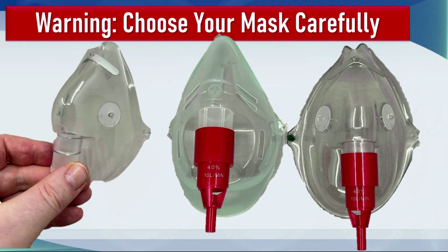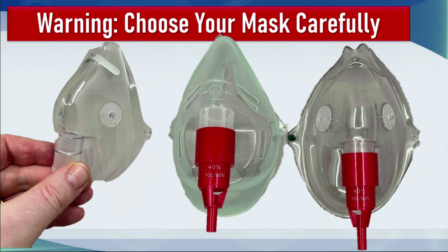The second face mask is for a nebulizer, and the picture on the left shows this more correctly, that there aren't any holes there. There's this little bit of plastic that covers over the holes on the inside, and these are used for much higher flows. And if you put this mask onto your face, it almost smothers you. It's absolutely horrendous. So don't put these on to someone who's on a Venturi. They find it really hard to exhale.